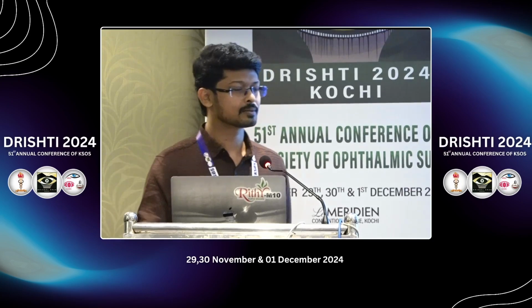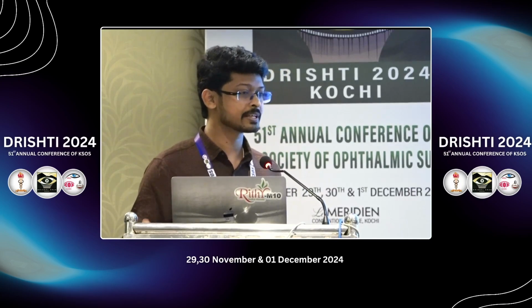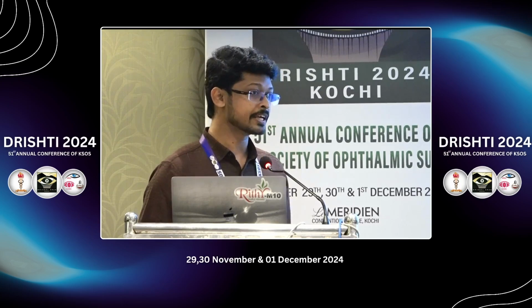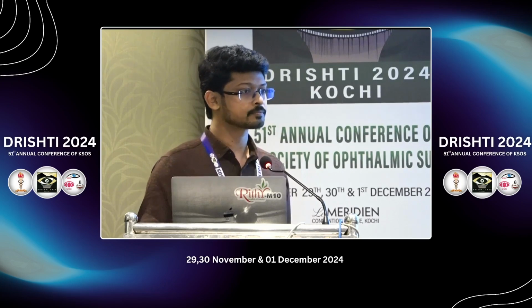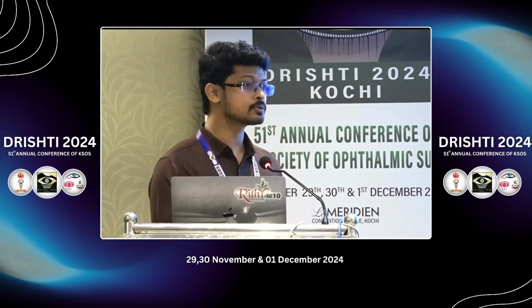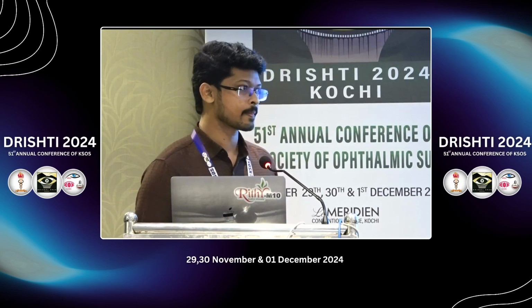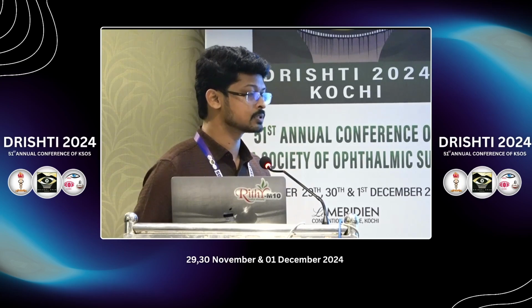Etiologies were there. Intermediate uveitis was there, but OCTA findings were very few, because if there was neovascularization into the vitreous, we could find it. There is a double component, posterior and intermediate. Relatively, posterior uveitis has more findings than intermediate. If they had neovascularization coming into the vitreous, we could find it. Otherwise, fewer findings. So even pars planitis will manifest as macular edema. The most common cause for visual loss in pars planitis is macular edema. Yes. They will come to you.